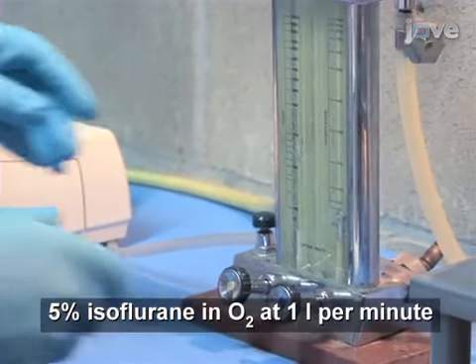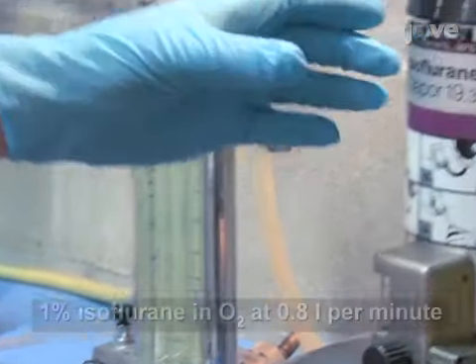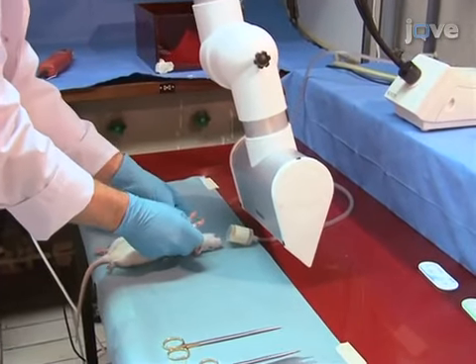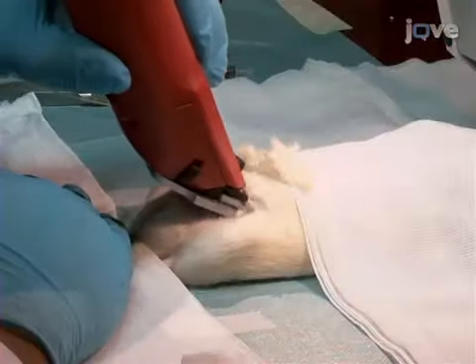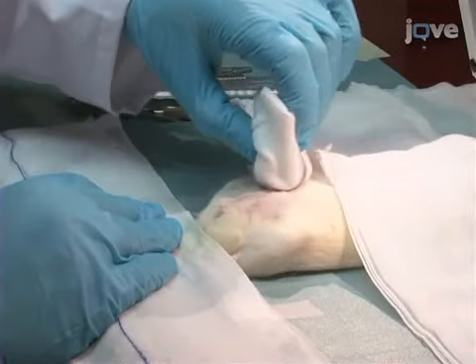Now, induce anesthesia in a 10 to 12-week-old female rat with isoflurane. After inducing anesthesia, set the maintenance level of isoflurane. Position the animal on its back and place a small anesthesia mask made from a 10 cc syringe. After shaving the abdomen and disinfecting the dermis, proceed with the surgery.